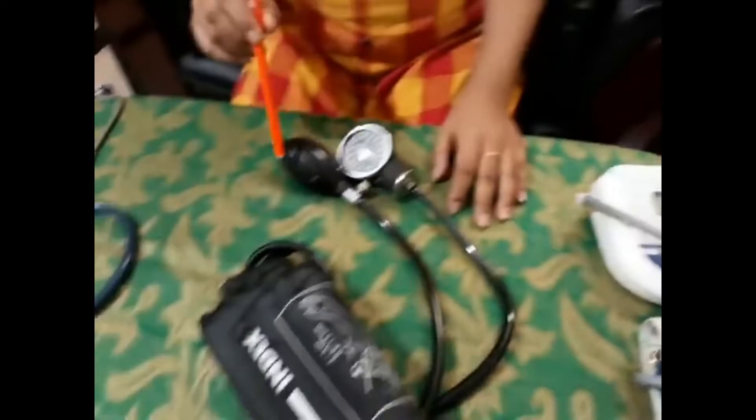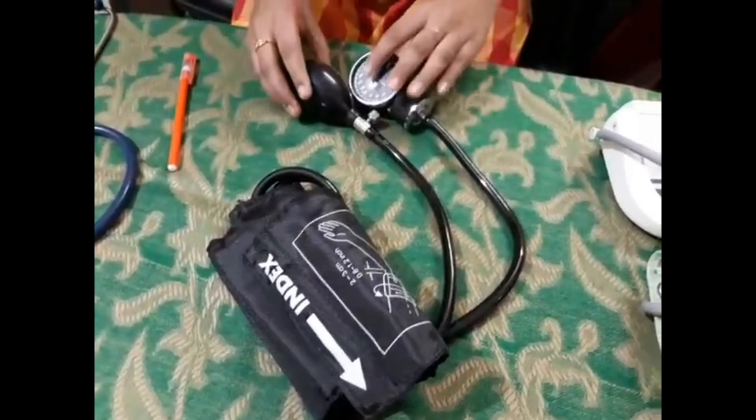There are three types of sphygmomanometer: a mercury sphygmomanometer, a digital sphygmomanometer, and an aneroid sphygmomanometer. In this video, we are going to see how to check blood pressure using this aneroid sphygmomanometer.